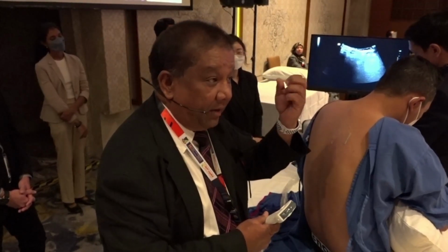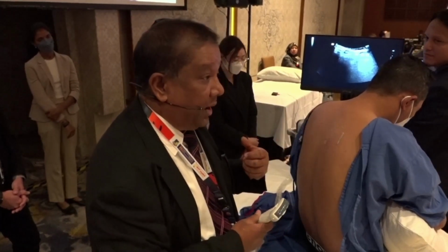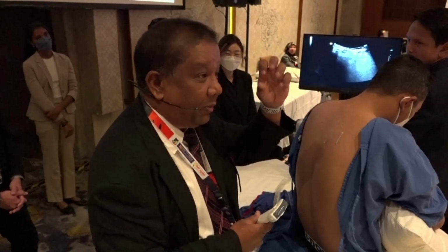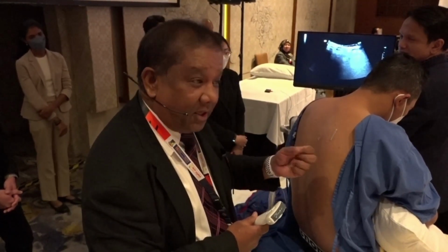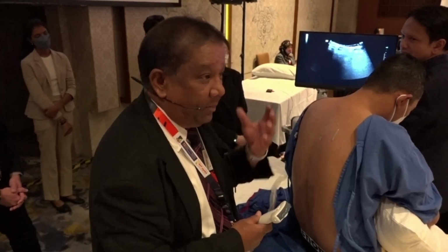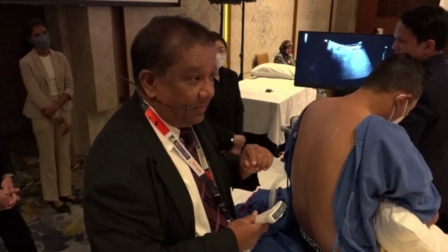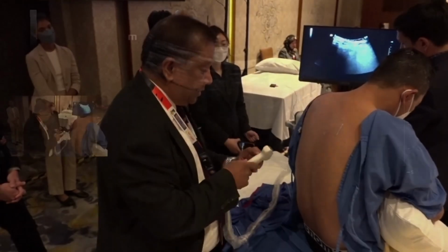You have to train your left hand or your non-dominant hand. So when my fellows come in my department, I give them a medicine ball. You know, a little rubber ball, right? I said, when you're not doing anything, not thinking of anything, just keep squeezing this ball. By 6 months, they become really good at the hand because these are small muscles in your hand which you never use. You have to train them because otherwise it's difficult to hold the probe and keep it stationary.